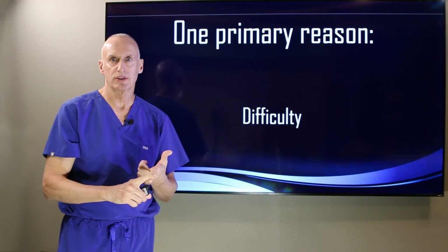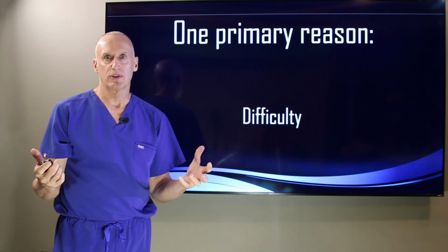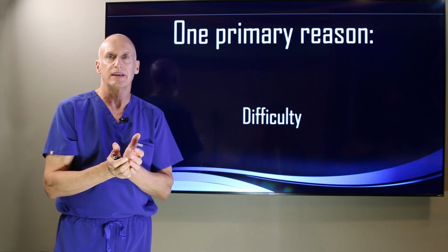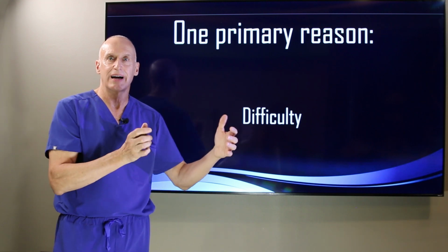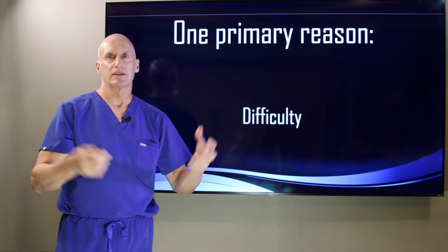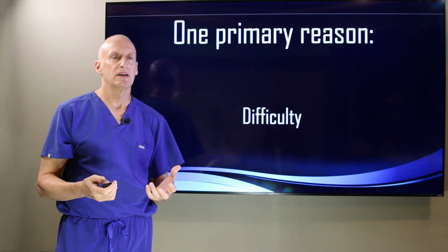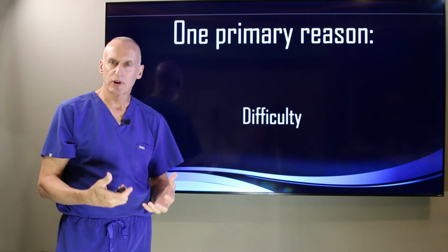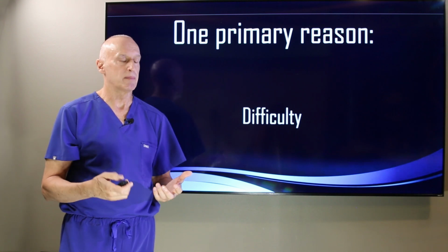I'm not in a rush. If it takes me 4 hours to do your surgery, it takes me 4 hours to do your surgery. You're my only patient that day. So I'm not on this tight timeline where I have to get to the next patient and the one after that to make 3 times as much money. You'll be the only implant patient that day in our office. So we're able to go slower and make better decisions without bone removal.